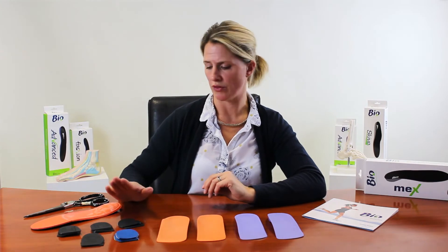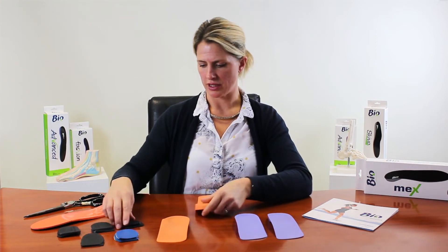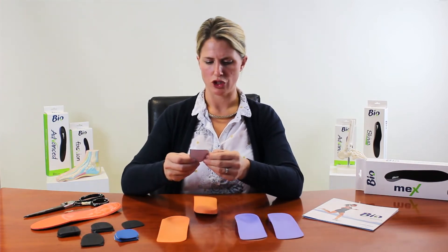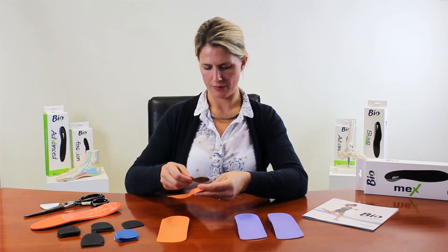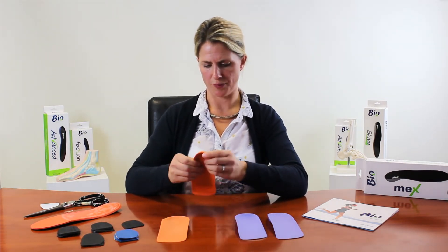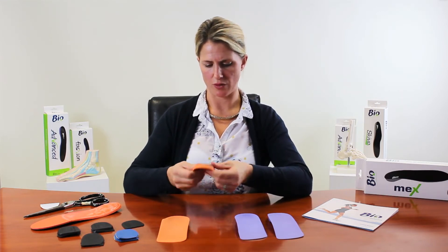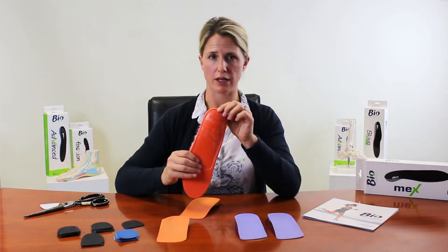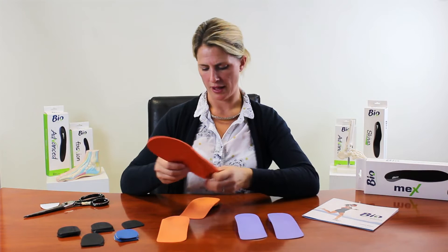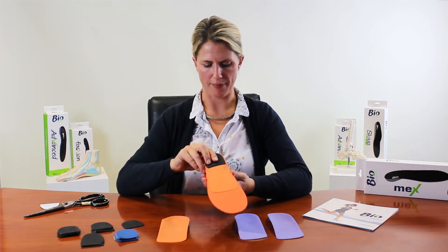For rear foot posting, we normally use medial wedging, but you could put it on the lateral side if needed. There are two, four, and six degree options. As a simple demonstration, I'm applying a two-degree medial rear foot wedge — it just sticks on, and then you peel back the adhesive and pop the cover on.